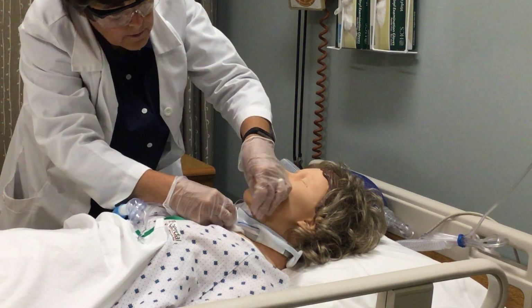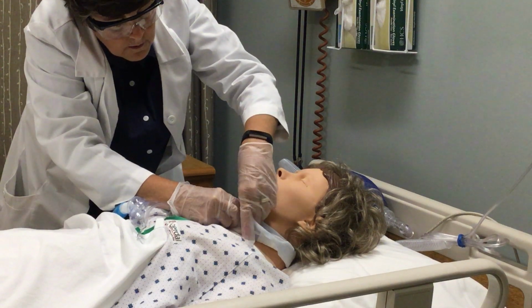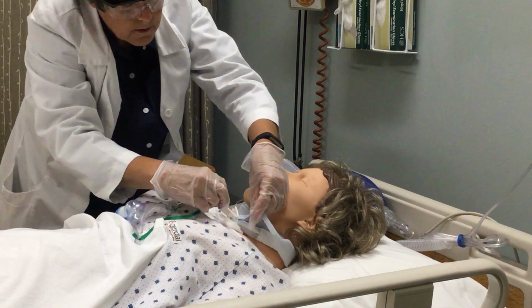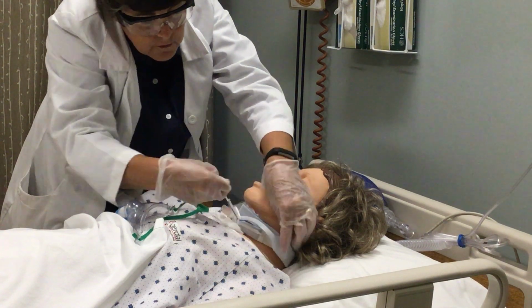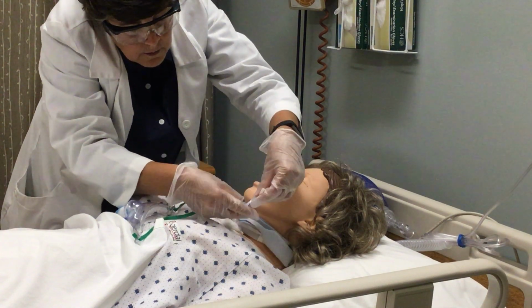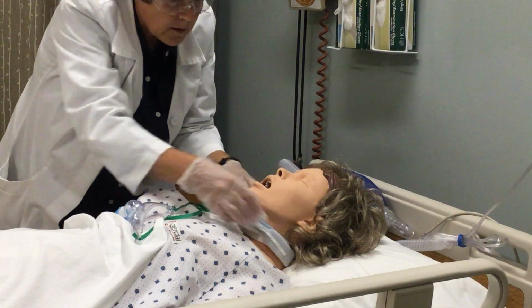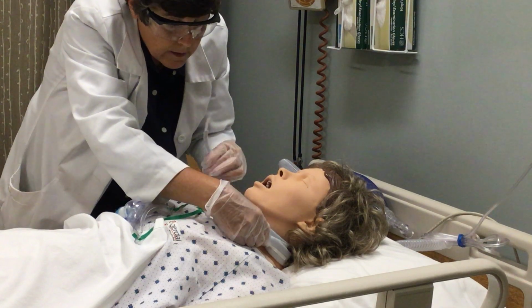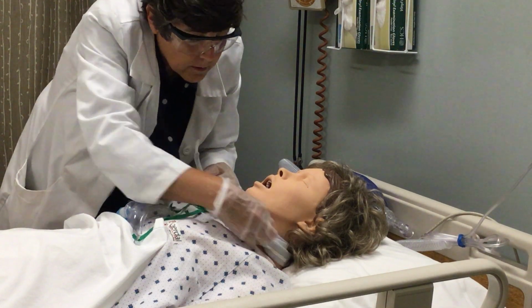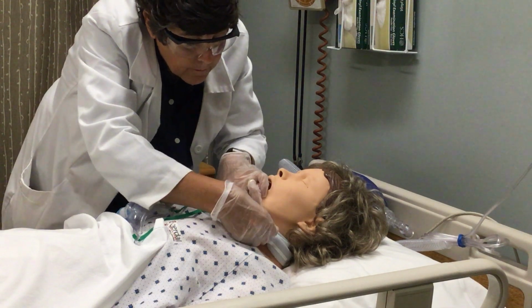Get in here with her, Miss Cruiser. Okay. So I'm going to secure that one first. Now that I have a hold of this new one, I'm going to loosen up the Velcro of the old one.